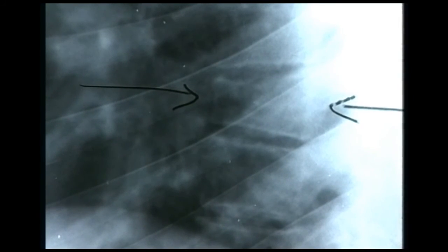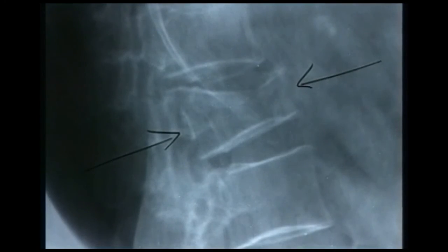This rather elderly patient complained of pain in the lumbar spine, and there's a fracture almost certainly resulting from osteoporosis. There's quite a lot of loss of height at the front of the vertebra, but the height at the back is still normal — the same as the vertebra above and below. This would almost certainly be a stable type of injury.